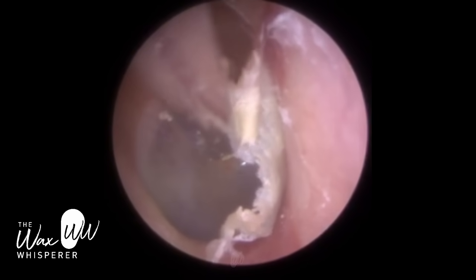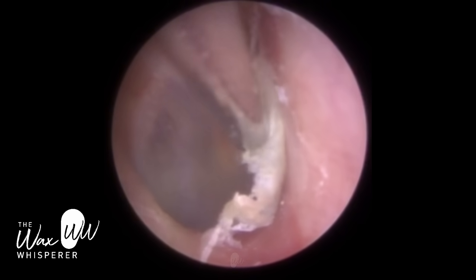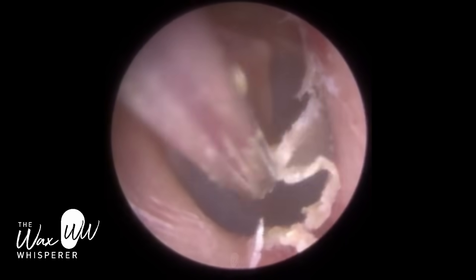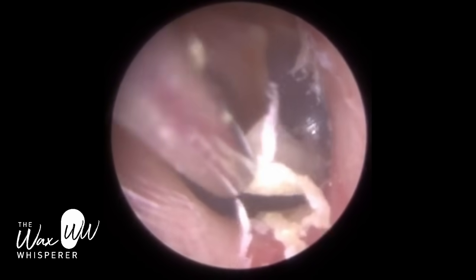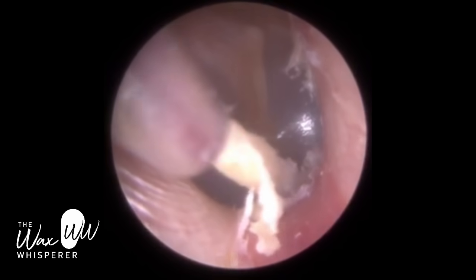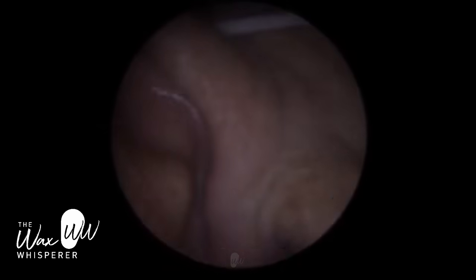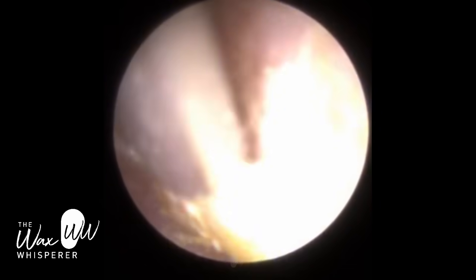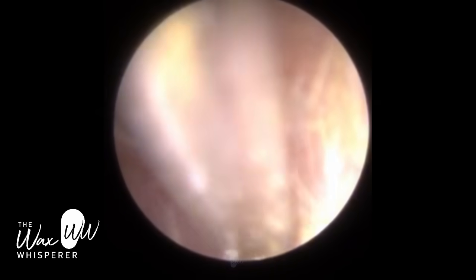I've just gone back in with the Zolnir suction probe. The forceps did help, but the suction also has a pivotal role. Just trying to lift this off, get a suction grip, pull away and towards me - you can see I'm almost trying to tear this. I'm using a fine end gauge; otherwise it clarinettes. When you suction dead skin, it can emit a very loud, almost deafening high-frequency squeal. We call that clarinetting - the skin just flaps at the entrance of the suction probe. It's extremely loud even for the clinical ear care specialist. So attaching the fine end gauge is best to reduce and limit any clarinetting.